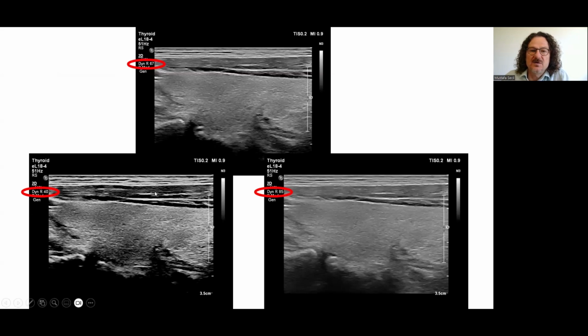These are the dynamic range values, very low. You see black and white tones. And this is more gray tones, but this is an optimal one for discrimination of echoes from each other. So higher dynamic range does not mean the good one. Optimal dynamic range optimizes the contrast.